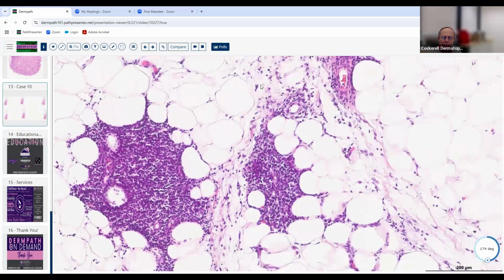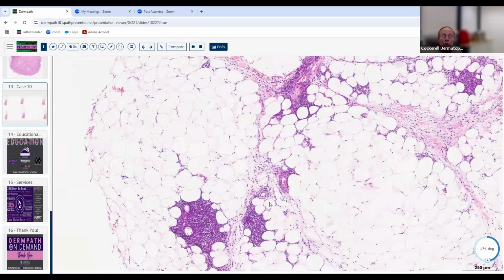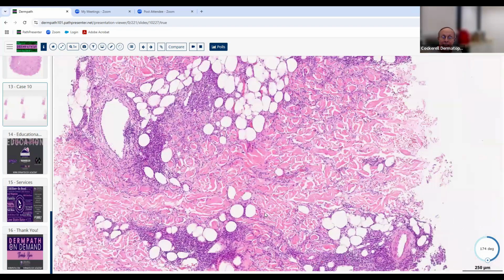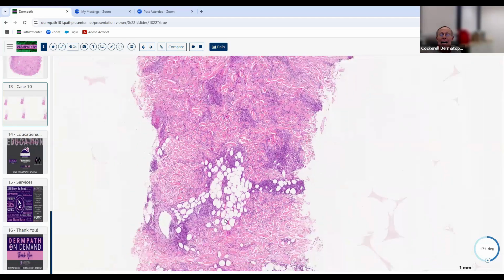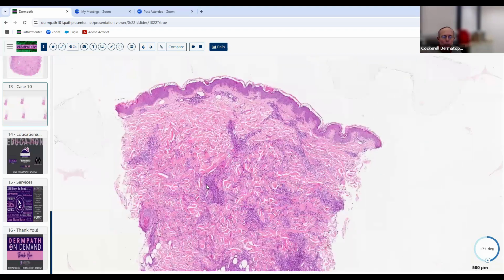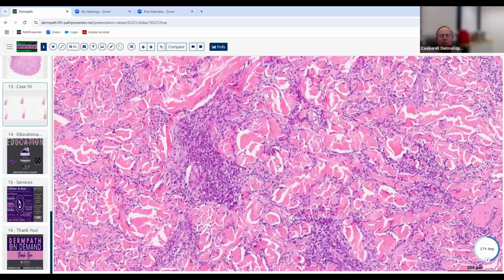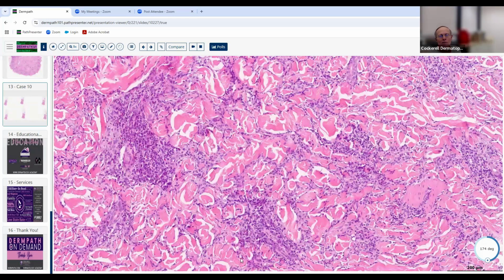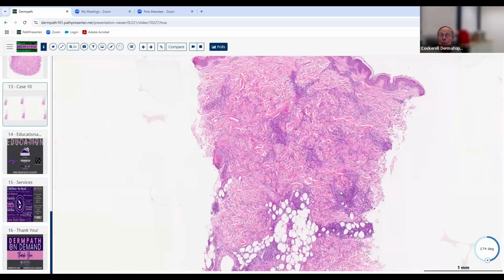So this is what you see when you biopsy somebody that's got Lyme disease or the so-called STARI syndrome, which is basically like Lyme disease. It's a Borrelia disease that they haven't really identified the Borrelia yet in the southern part of the United States. And if you biopsy the bite, the hit site area, it often looks like this. So this is more just for your interest. You will never see anything like this exactly on the board examination unless they gave you a lot of information, because it's just too esoteric. But it's a nice example of a pattern.